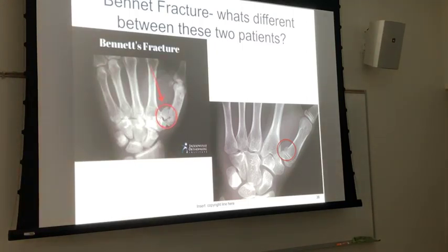In young pediatric patients, the first time you take an x-ray of a kid's wrist or hand, you'll be shocked by how few bones they actually have. It's all cartilage and you can hardly see it. The rest of the bones are very well delineated. Oddly enough, the rest of the metacarpals look like the growth plates are sealed up, but in that particular thumb, the thumb's still got some growing to do.